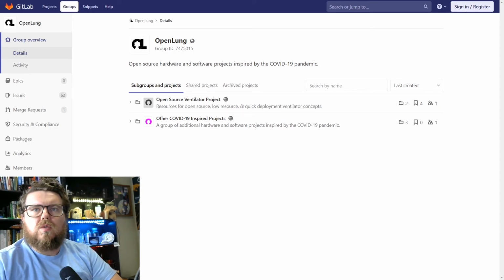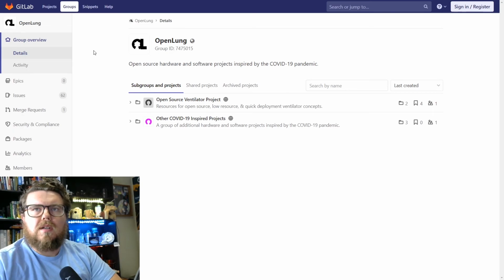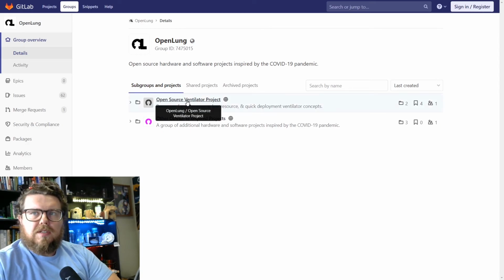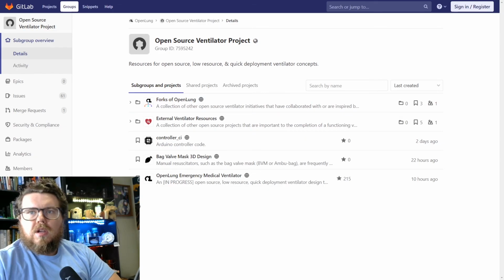I'm going to show you how to explore some of the design files for the OpenLung open source ventilator designs through our GitLab. Starting where we left off in our last video, we are on our group page for OpenLung. If we go into the open source ventilator project, we can see lots of subgroups as well as projects that are happening within this group.